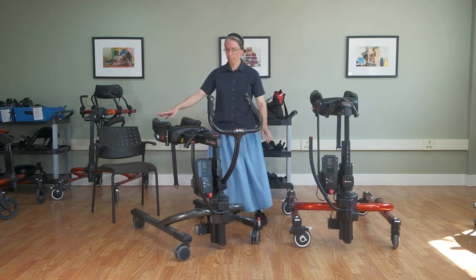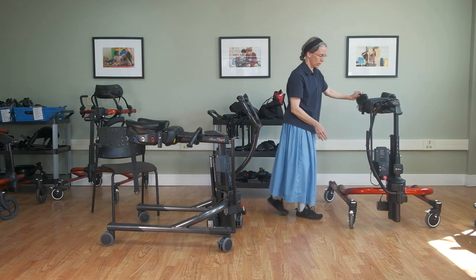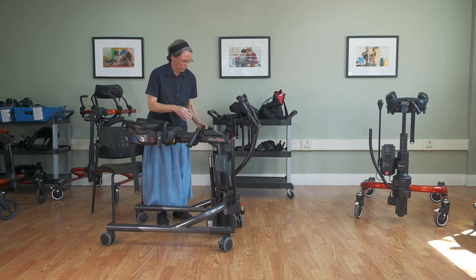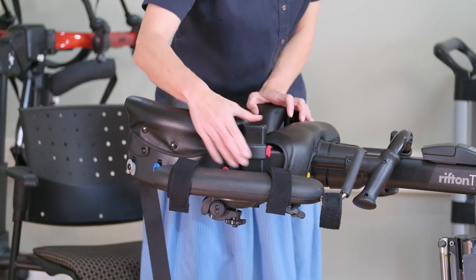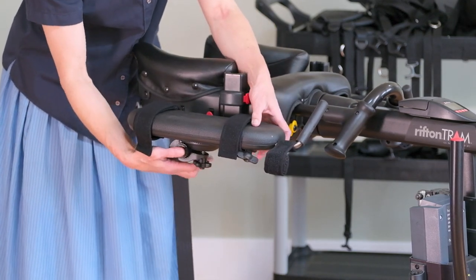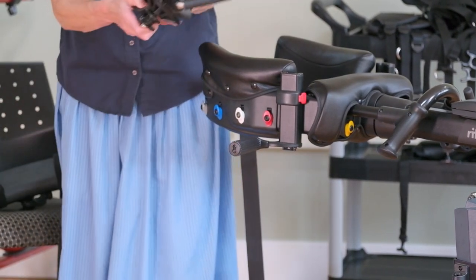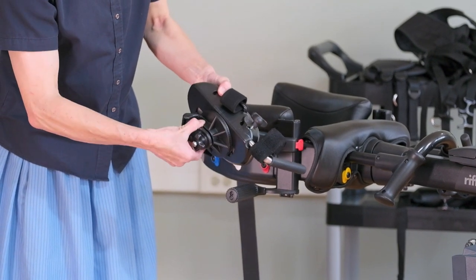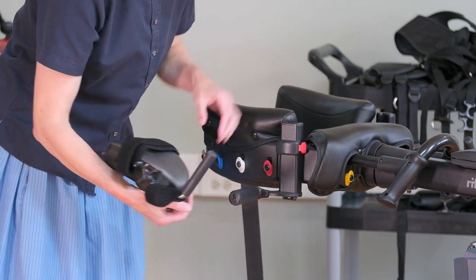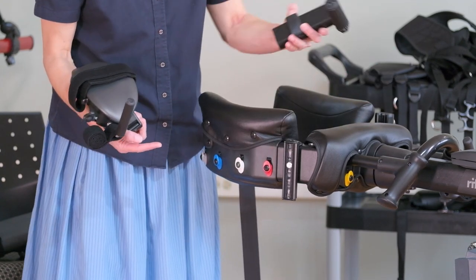I'll take a moment to show the arm support options — and what I show you here fits exactly the same on the e-Pacer. We have the possibility of arm platforms, which secure with these posts. The straps are removable and the hand grip is removable if you'd prefer just the straight platform. We also have the possibility of arm prompts — forearm prompts similar to what you see with the Pacer. With this one knob we can turn the position so it can be farther forward or farther back, and the post itself can also be placed up or down.